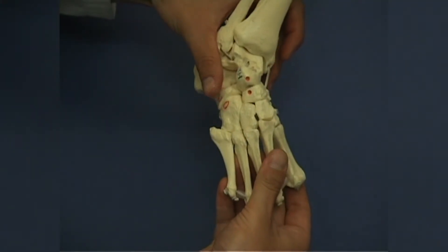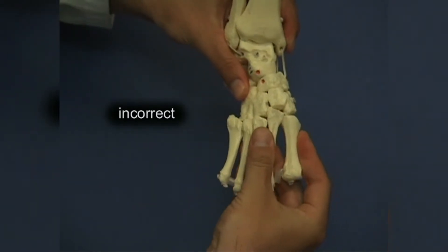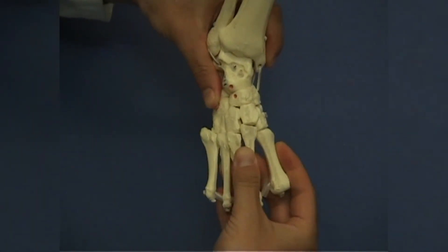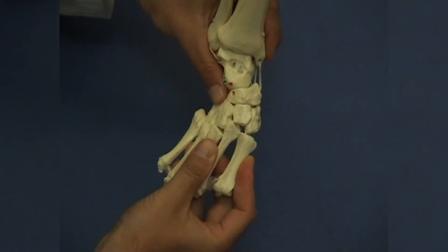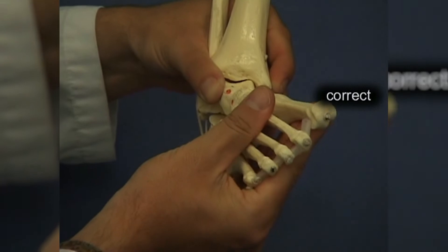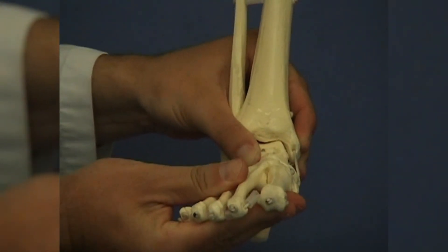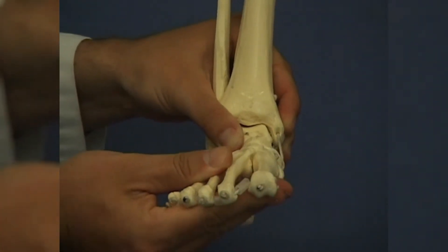Here is a demonstration of incorrect manipulation techniques on the calcaneocuboid joint. Correction of the adductus is achieved through a secondary deformation in the midfoot area. It is not possible to correct the deformity along the other planes by fixing the calcaneus. Instead, manipulation against the fixed talus corrects the clubfoot in a natural way by complying with the physiological movement direction in the subtalar joint.